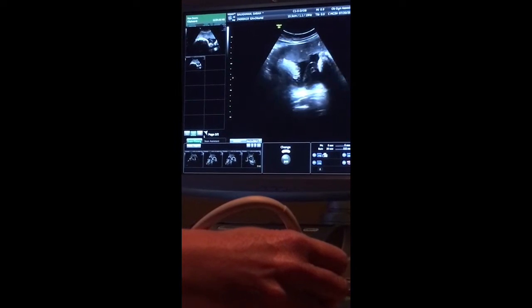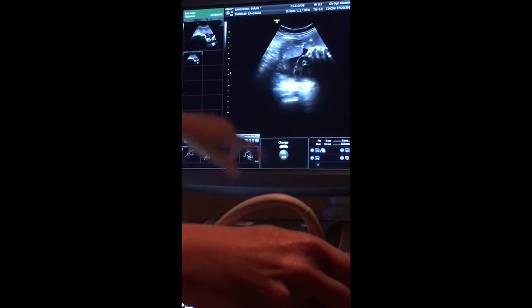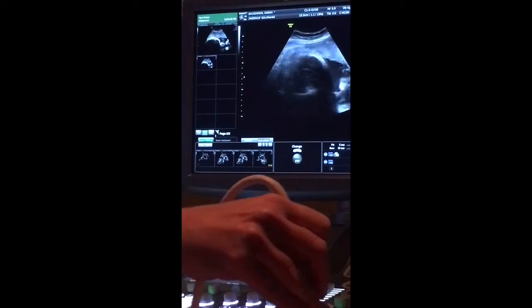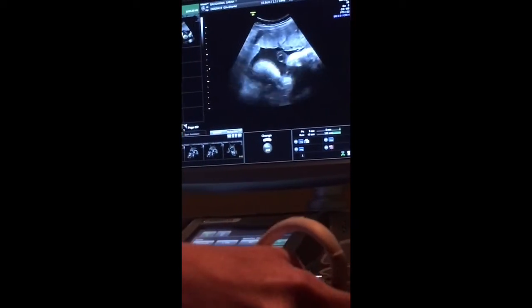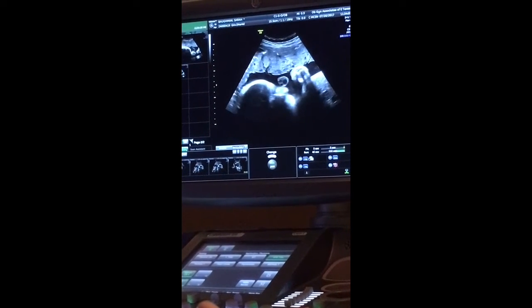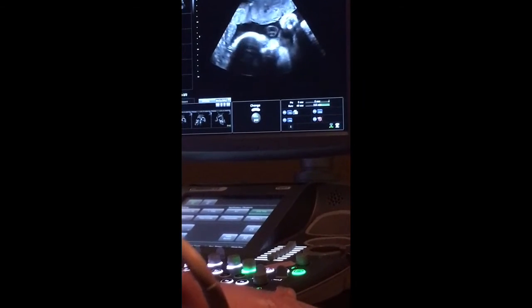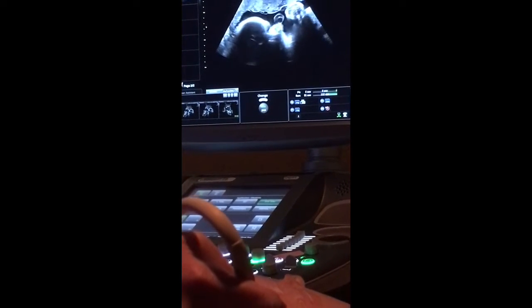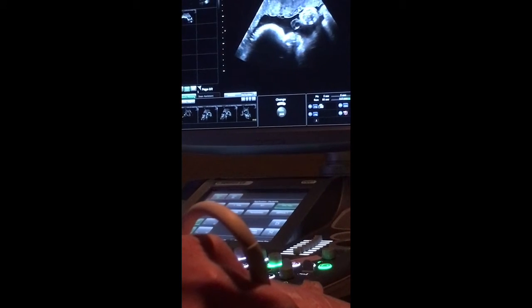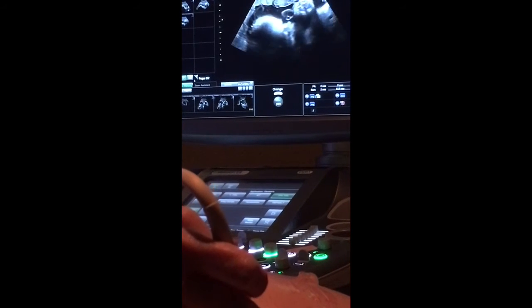Okay. She's got a lot of hair. A lot. So this is the top of her head, and see all these little lines, that's all hair. That's cool. There's her little face. She's blowing bubbles. It's her cord. It does look like bubbles. You can even see that hair kind of standing up on her head. That is so cool. I cannot wait to see what color hair that has.